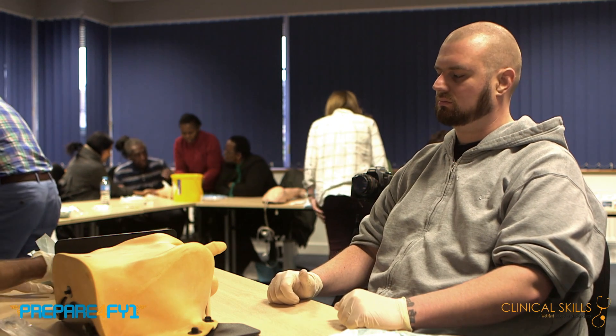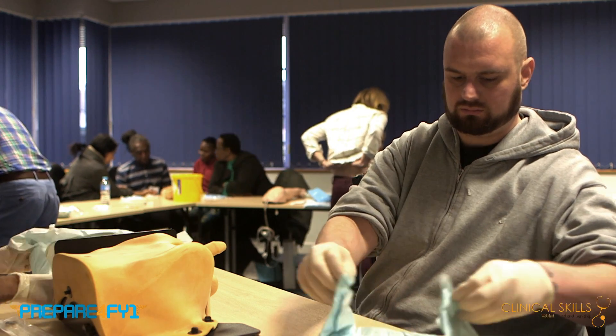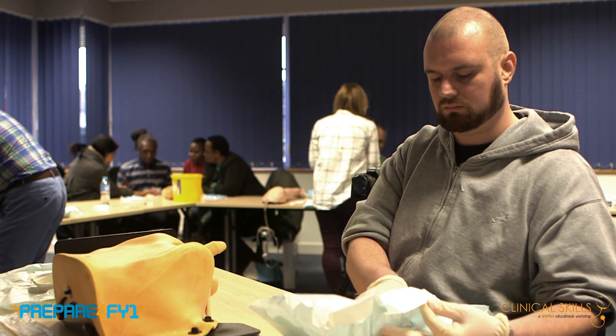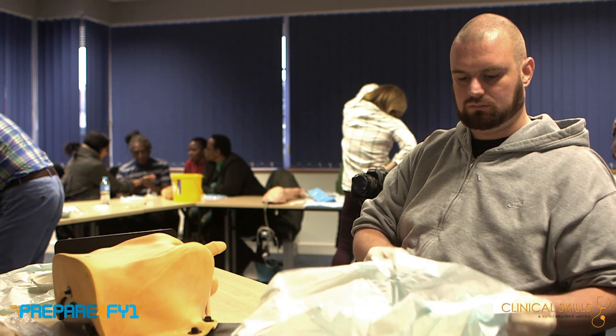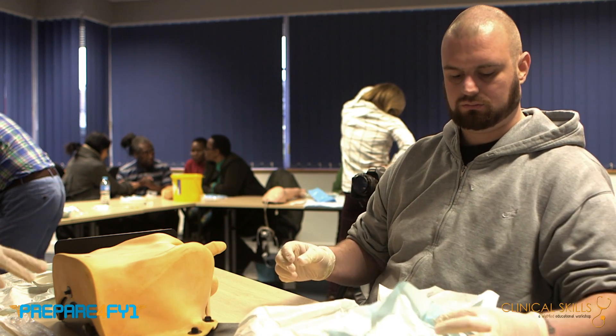On the back table, start doing this now. Open up the blue bit and keep it nice and flat and straight all the way as you're doing it. When you're doing these procedures, it's really important that everything's clean and sterile. The way of ensuring that is you prepare all your equipment before you start needing it.